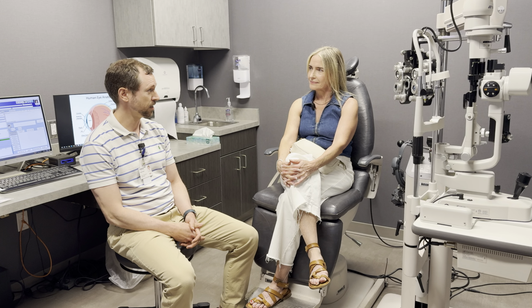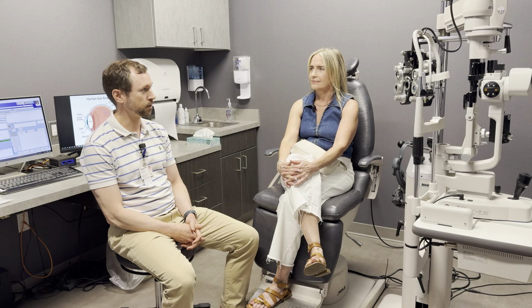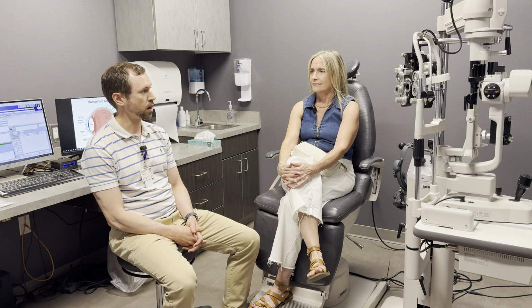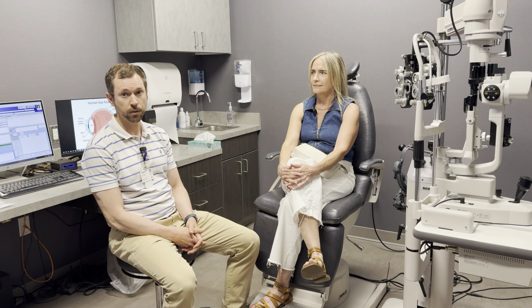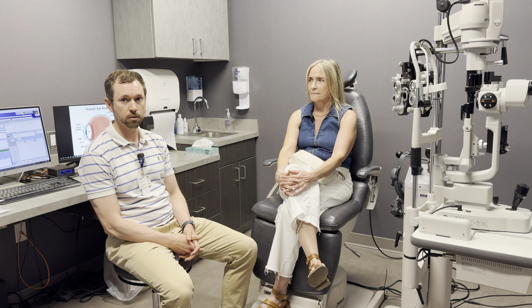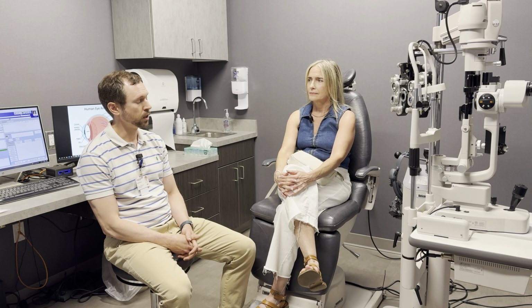You are 20/20 in both eyes at distance. Just for nerdy doctor speak, for those who care, she is plano in her right eye, and her left eye is -1/4. She has probably about 1/4 of a diopter with-the-rule cylinder in her left eye, which she will age into nicely. That will likely soften as she gets older.